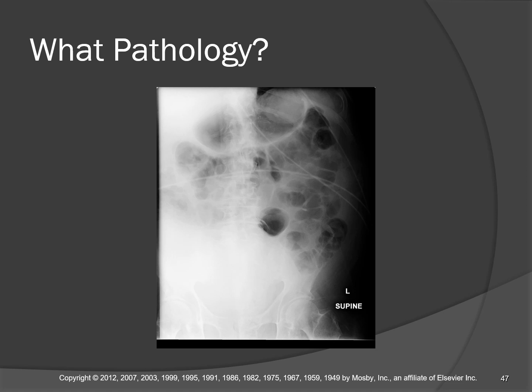And this looks like the patient has a hematoma filling the pelvis and the right side of the abdomen. And it also is displacing the colon and the small bowel over to the left side. That's why all the air is over there. The hematoma is taking up room, and so it's pushing bowel loops out of the way to take up the space of basically the right lower quadrant.